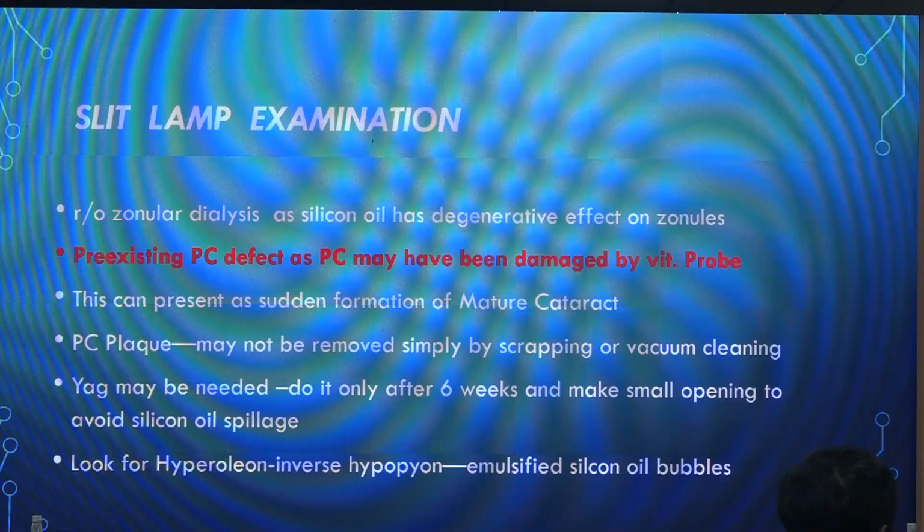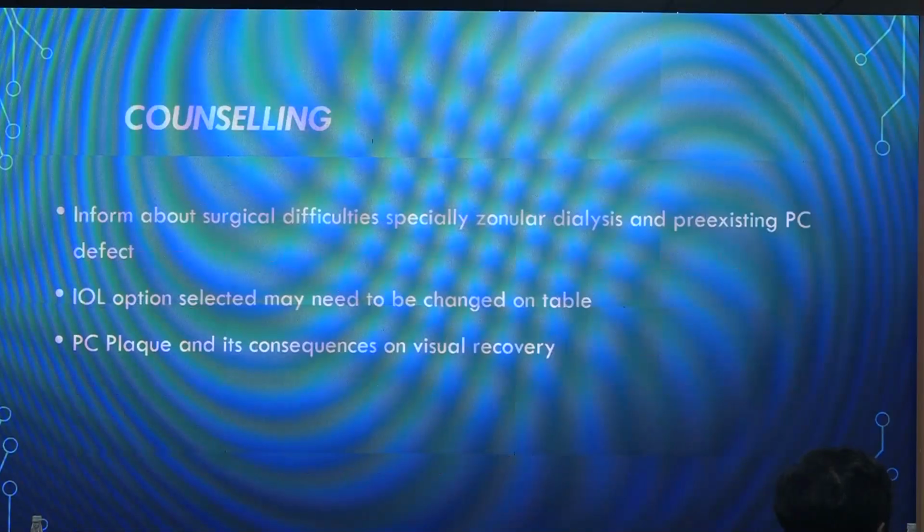Then PC plaque. This may not be able to be removed simply by scraping or vacuum cleaning during surgery. So YAG laser may be needed, but do it only after 6 weeks and make a small opening to avoid silicone oil spillage. Inform about surgical difficulties.